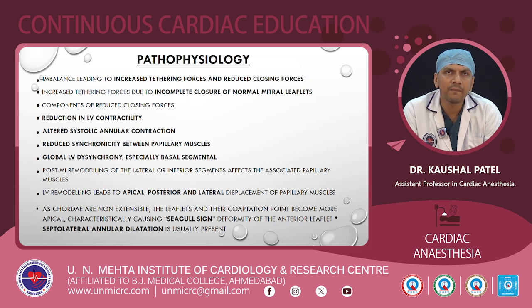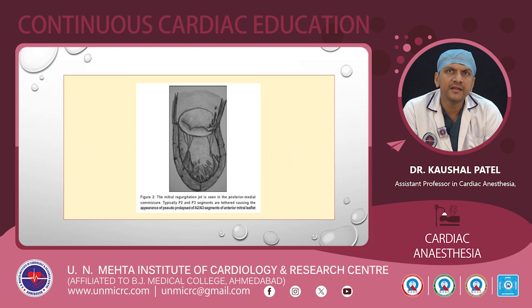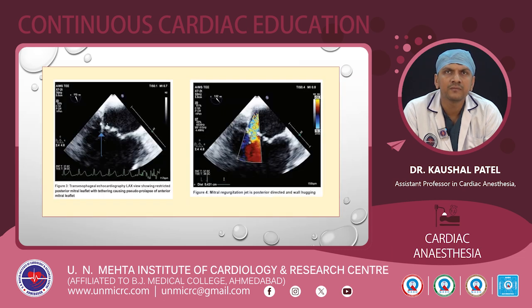LV remodeling leads to apical, posterior and lateral displacement of the papillary muscle. As the chordae are non-extensible and the leaflets and their coaptation point become more apical, there is a characteristic sign, the Seagull sign deformity, which we can see in the next slide. So in ischemic MR, basically the imbalance of the tethering and closing forces causes mitral regurgitation during LV systole.